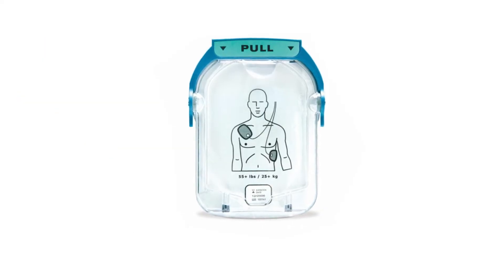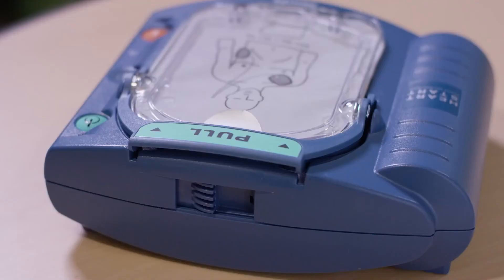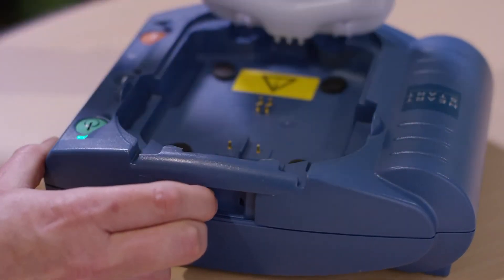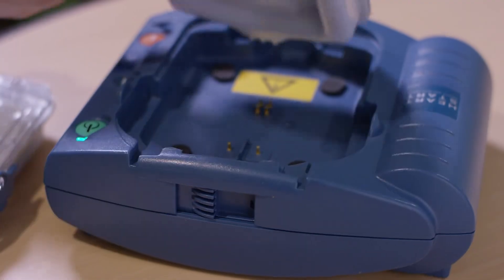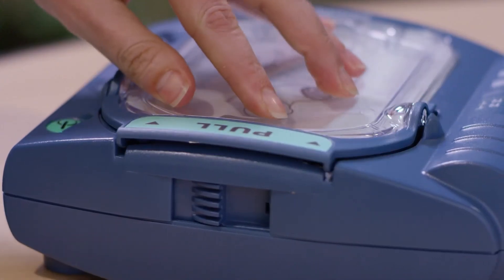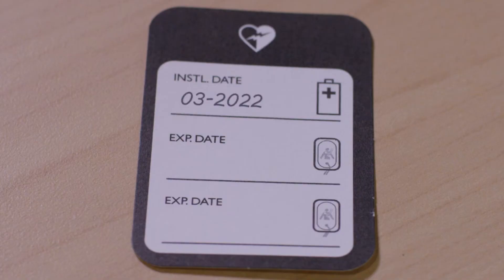Philips SmartPads are single-use only and need to be replaced after deployment. To install new pads, use the latch on the top of the unit and slide it aside — this will release the cartridge lock and allow the spent cartridge to be removed. Open a new SmartPads cartridge and slide it into the cartridge recess. When the cartridge is properly placed, there will be an audible click. Ensure the green pull handle is all the way down, then record the replacement of the cartridge in the maintenance tag.